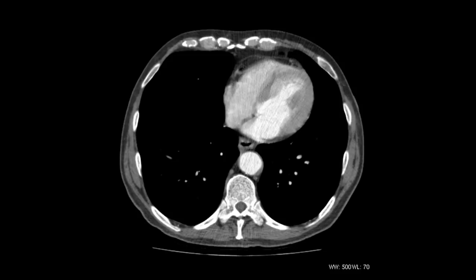Without getting too bogged down in the physics, the window you use will depend a bit upon what you're interested in. You can see at the bottom of the screen there are numbers which give you the window width and window level. CT works by giving you a value for how much radiation a voxel — which is like a little cube of tissue — absorbs. Air doesn't absorb very much, whereas bone absorbs a lot. So on this, you can see the bone is white and the air is black. You'd change the windows to get a better view of the lungs, and all these presets are available in all the PACS systems.